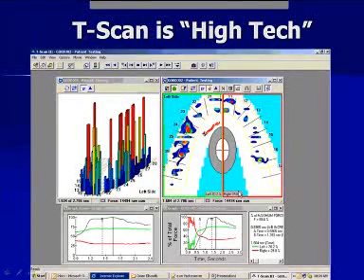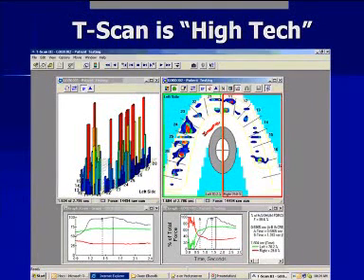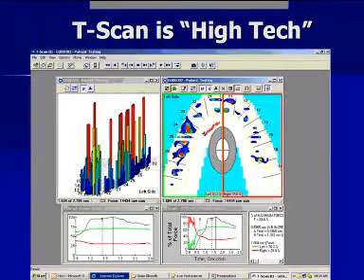What I want you to all understand is that what you're going to do is only going to take you 2 minutes. You're not going to need an extra 15 minutes added on to your hygiene appointment. You're going to use the data very quickly to assess the situation. You're not using it to change someone's occlusion at that moment. You can really tear apart the TScan data at a later date.